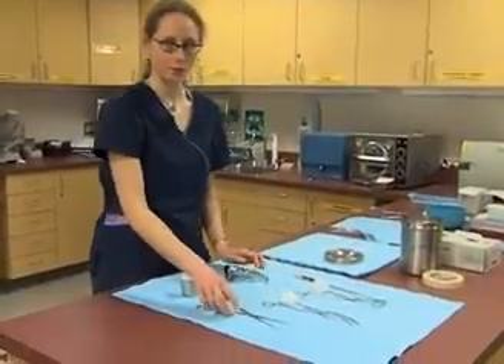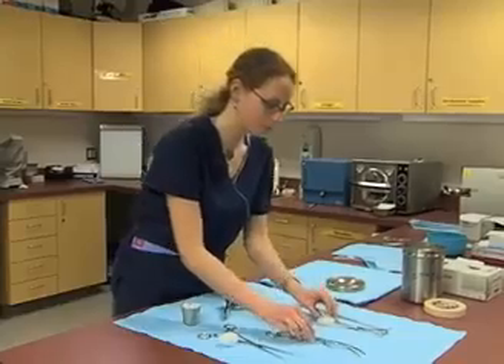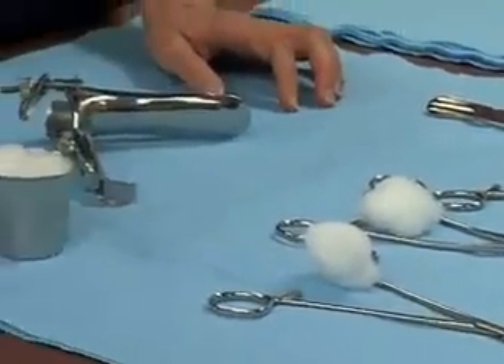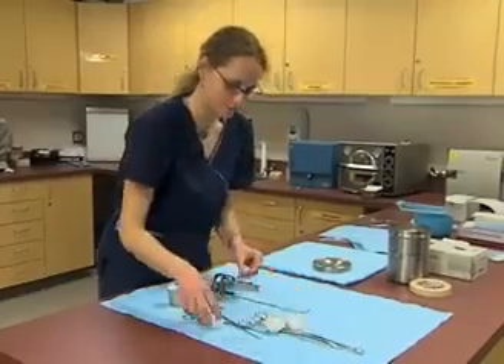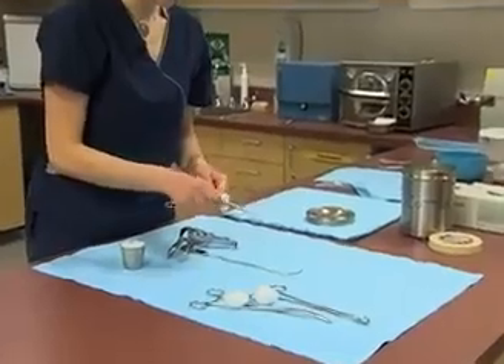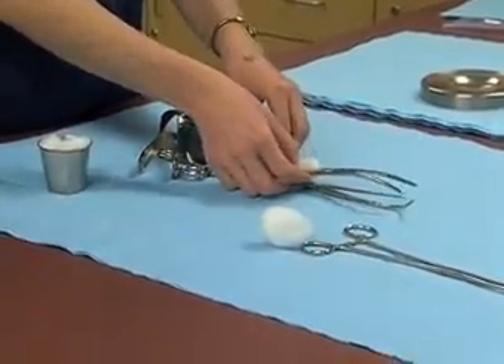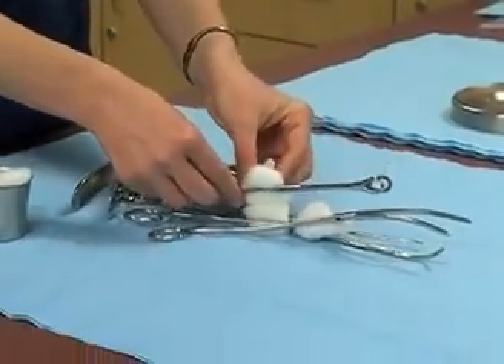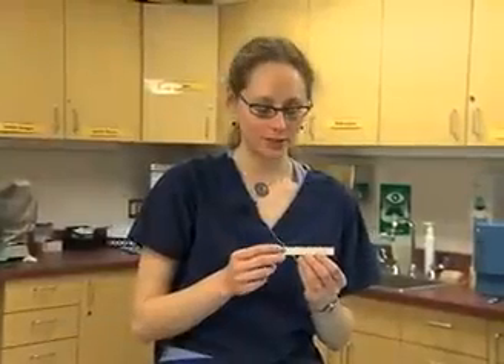We want to make sure that whenever we're putting together a package, we put it in an order that works well with the practitioner and how they would use the set. For the tools to assemble a vaginal pack — and this will vary from office to office — I put the speculum at the bottom, then the sound, then the tenaculum with the cotton, the uterine forcep next, then the towel forcep or ring forcep, and then I place the cup. The last item in the kit is an indicator, which tells us that the temperature inside the kit got to the proper temperature needed for the tools to be sterile.